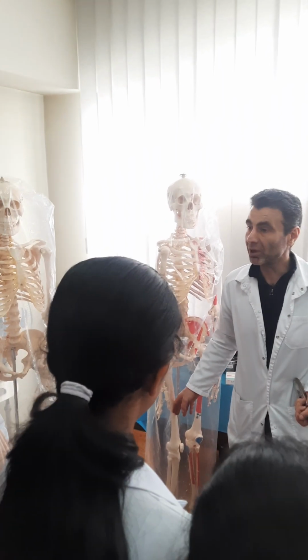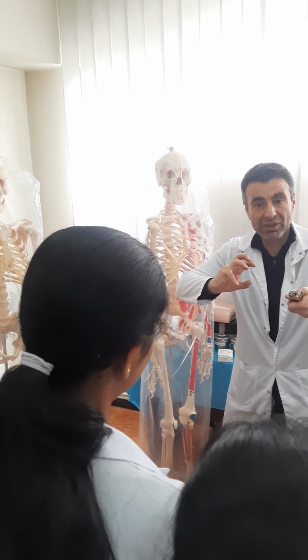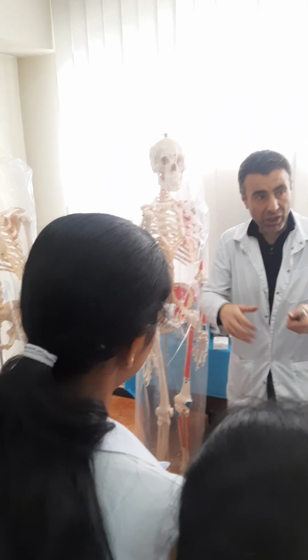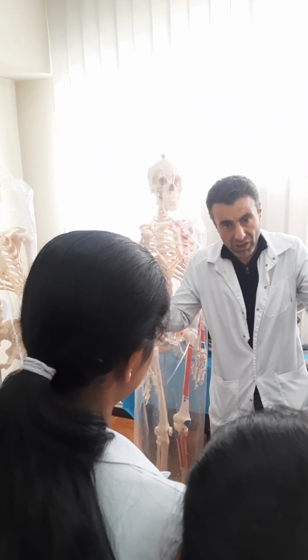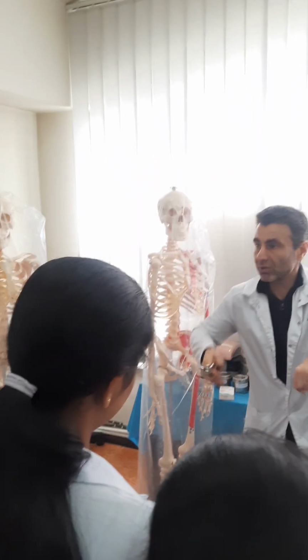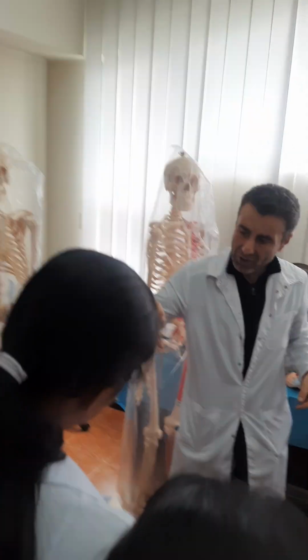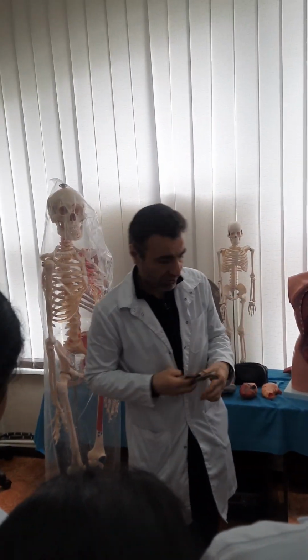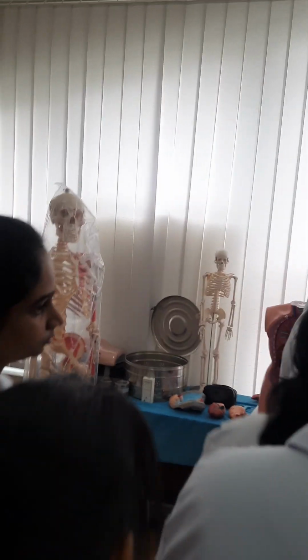Then this bone is damaged, then there are fractures, due to the contraction of the muscles. Usually it is retracted in abnormal positions. And before immobilization, what is immobilization? Then you fix the bone fragments, yeah, using metallical construction or something else. So you must make traction of the bones to put the normal anatomical position before fixation, yeah. That's why it has sharp tips. That's why you can fix, you can make the tractions. We call it sometimes crocodile. It's resembling the crocodile mouth, yeah.